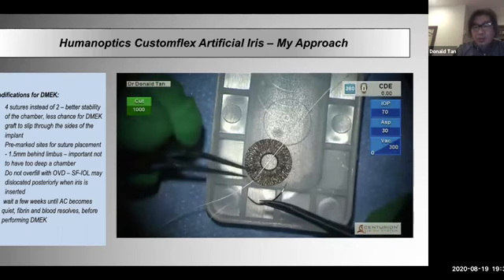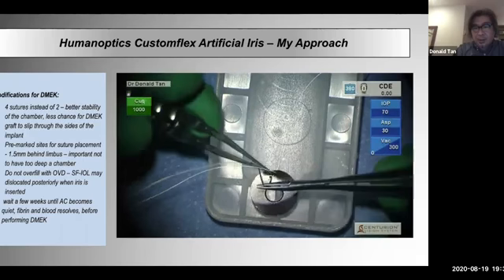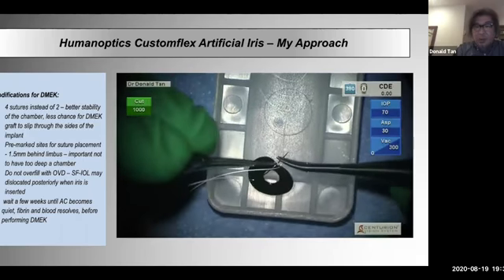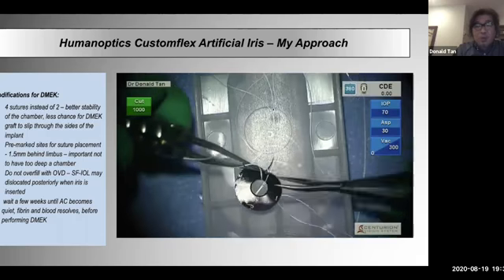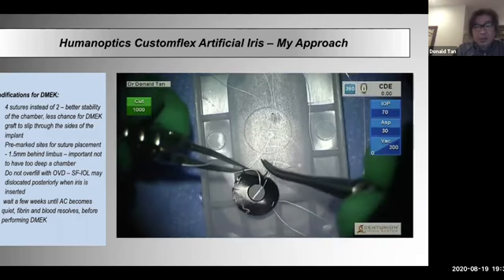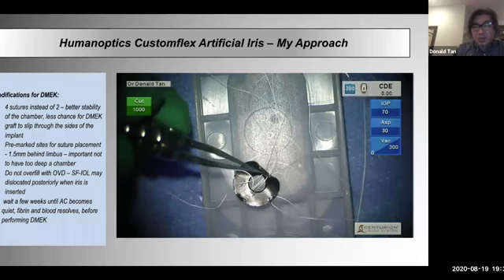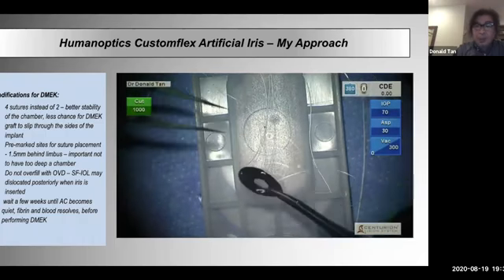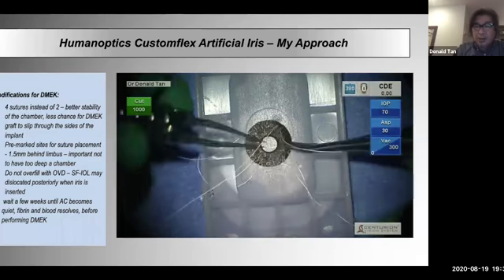And then you suture the implant in 4 quadrants. I just use one long Gore-Tex suture, and I just go along, so I save costs. I don't need the needles anymore. I cut the needle off. There you go. Okay, so we're already there, and that's the preparation.